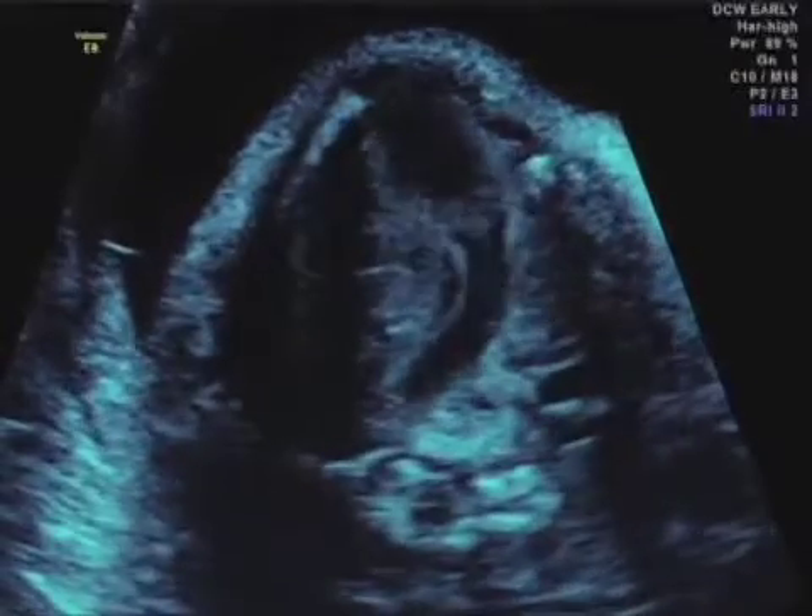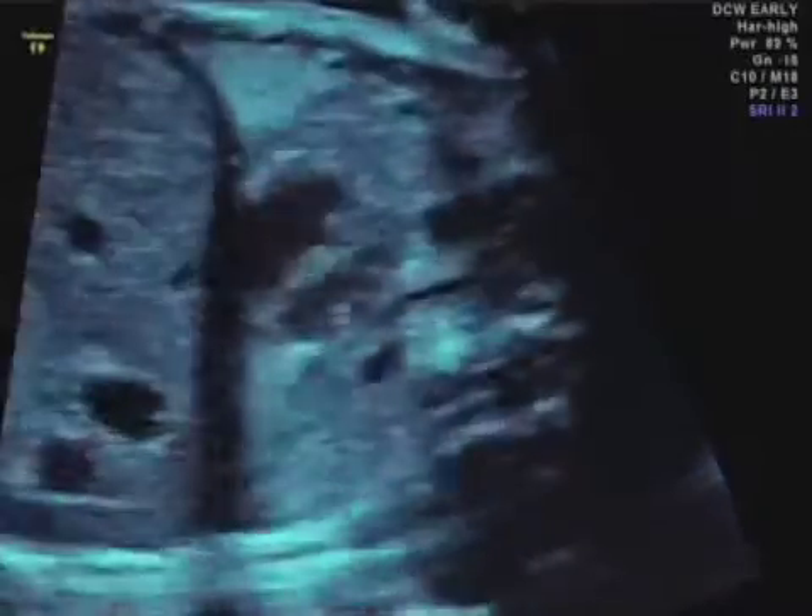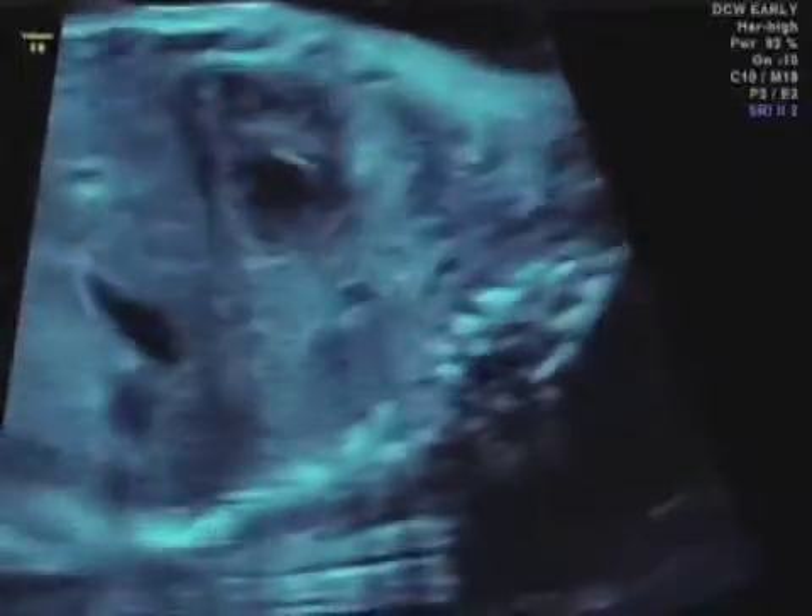So we have parallel great vessels — transposition of the great arteries. This is a D-transposition of the great arteries.